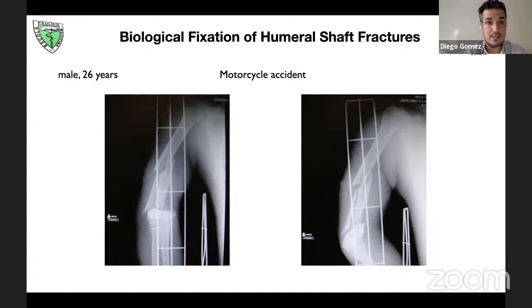So if you have this huge fracture alone, isolated in one patient, I think in our hands, in our hospital, we'll do a fast treatment of this, maybe the first day, if it's possible. And of course, this is not the patient for a nail, or at least in my hands, I would go with a plate. And having said that, I could see Dr. Shiva say, "Hey, I can nail this fracture."